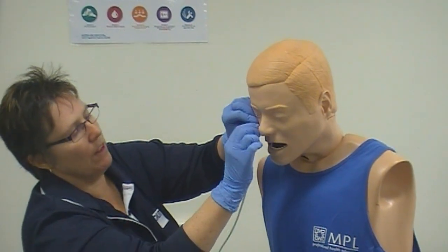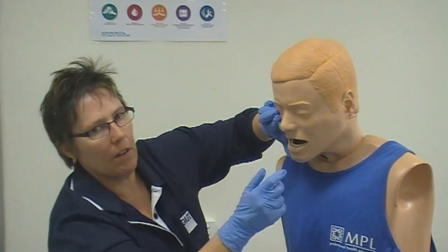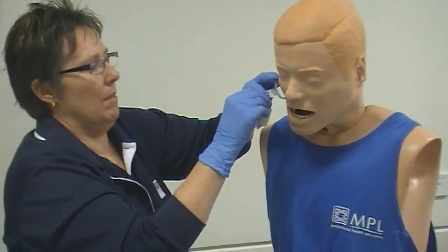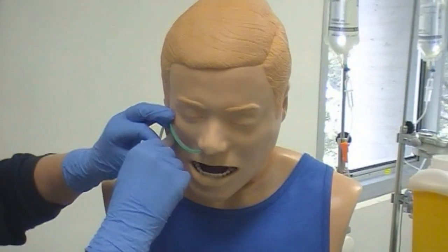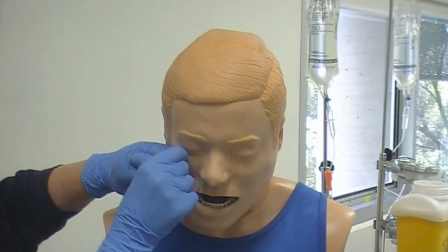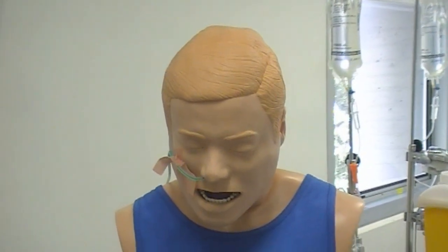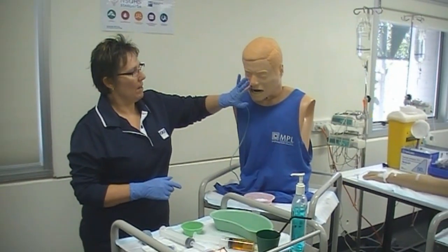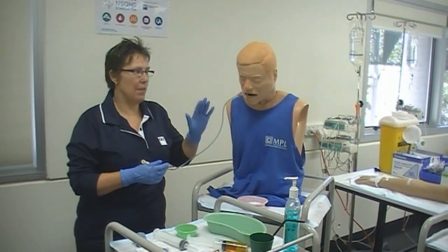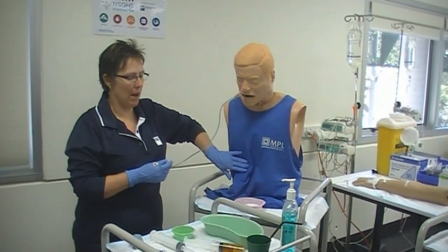I've now got the tube to the length I determined. I need to check inside the mouth — I might need a little torch — just to make sure the tube is not curled up in the back of their mouth. At this point I would secure the nasogastric tube temporarily, because I've still got to check the position. It is absolutely vital that I know that this nasogastric tube is in the stomach and not in the patient's lungs or curled up in the back of their throat or not far down enough.